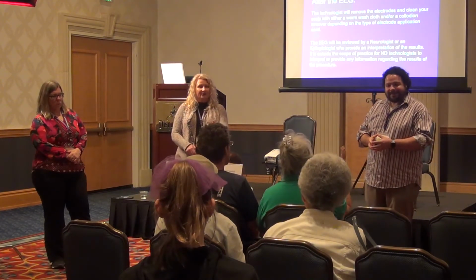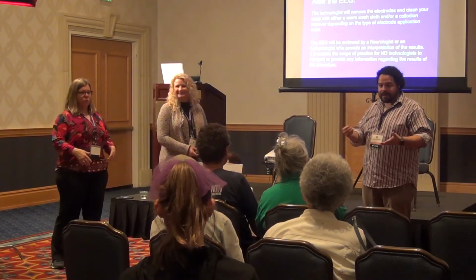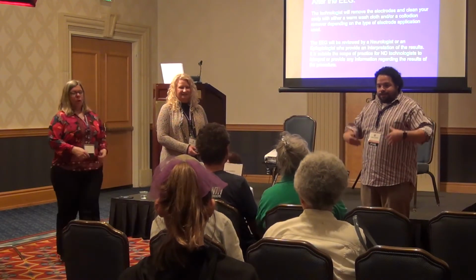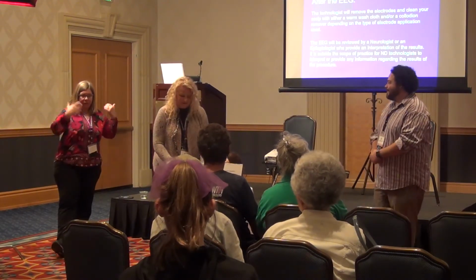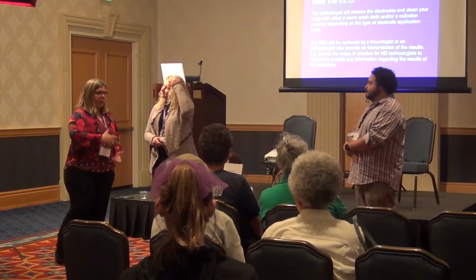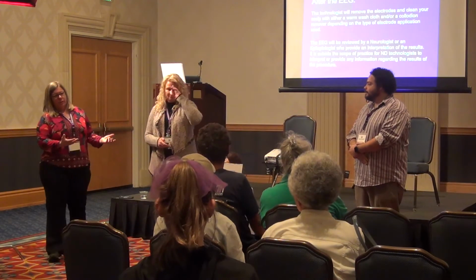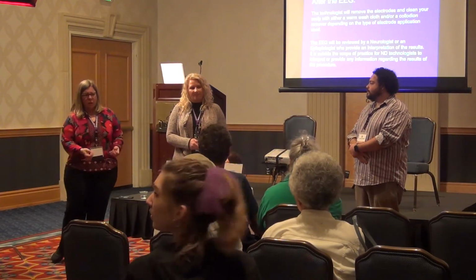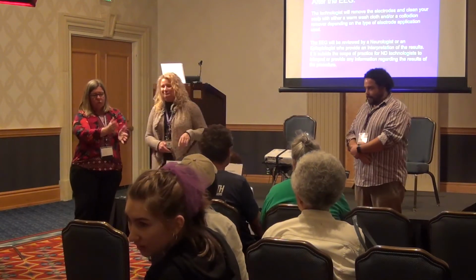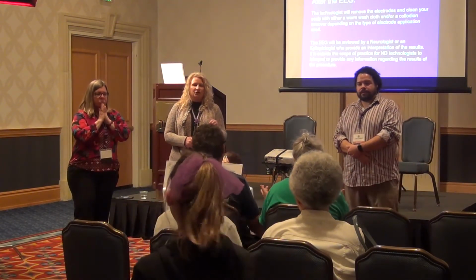Sure. So if I may, hyperventilation is the deep breathing exercise. You're breathing in and out deeper and faster than you normally do. And so you're trying to blow off all the CO2 on the brain during the exercise. So it's not like a meditative breathing exercise. That's where I was just going to go. It's exactly two different things. You need to have specific definitions of what you mean by deep breathing.